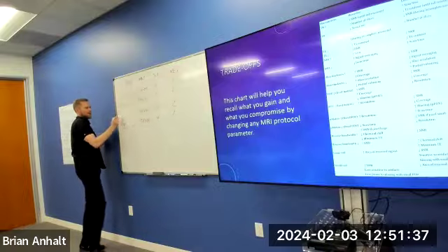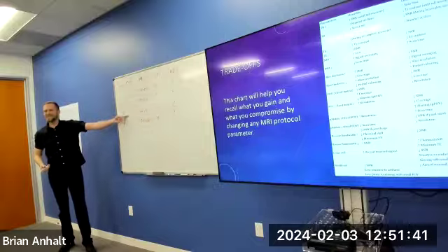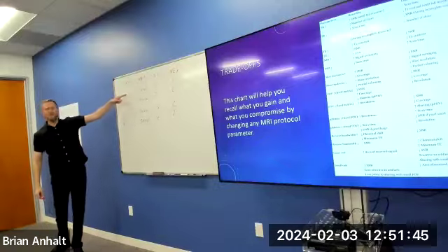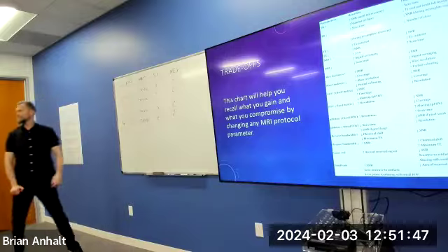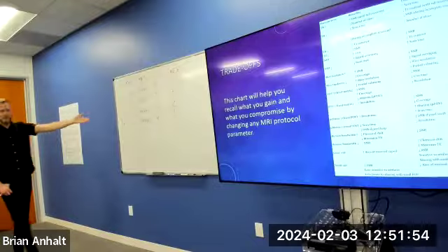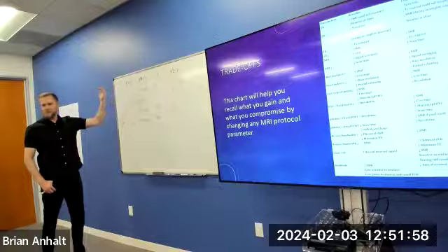Highest SNR, highest resolution. Lowest SNR. Lowest resolution. There will be questions like this. I'm not going to say the matrix is going to be the determining factor. Might not be. Use my trick.